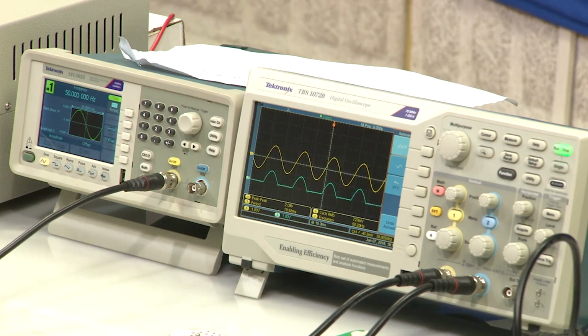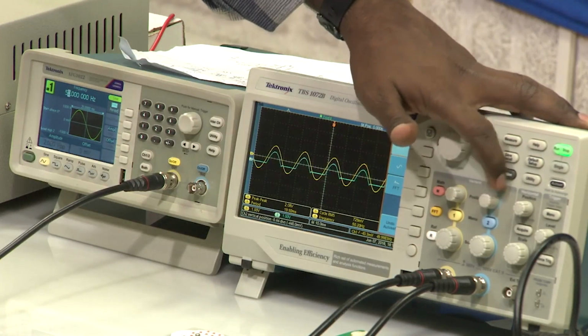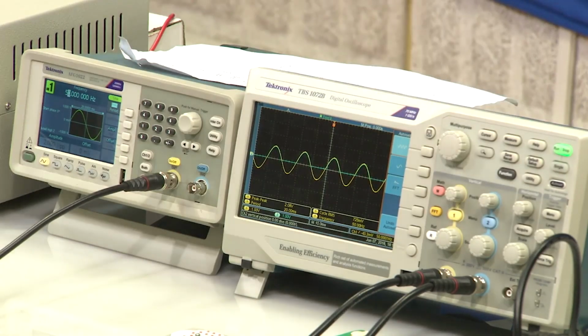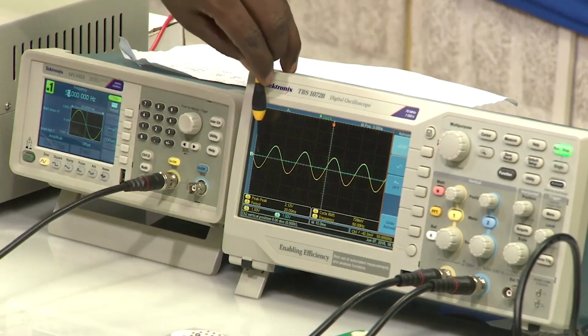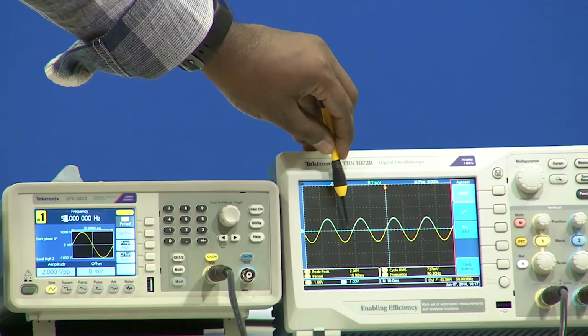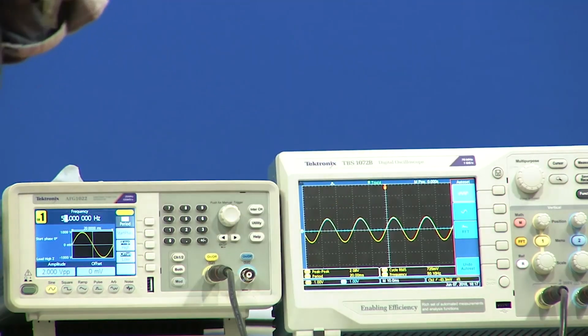The reason is that we have to find out only the positive peak, we do not need negative signal processing in this case. So that is the reason we are going with the removal of the negative signal. Now, if I observe, there is no negative signal. Whenever there is a negative signal in the input, the output is 0, and when the signal is positive it is passing through, and the output is 0 again when there is a negative. So it is completely removing the negative peak of our signals.